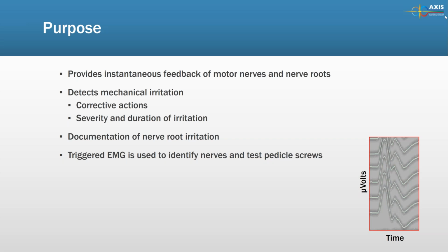We can also use trigger EMG, which is stimulation, to identify the nerves or check pedicle screw integrity. So the trigger EMG is used to find the nerve, to track the nerve, or to check the integrity of the nerve at the end of the surgery.